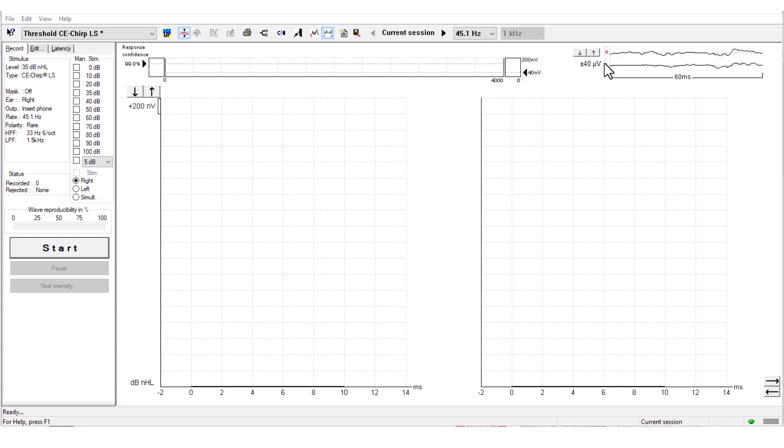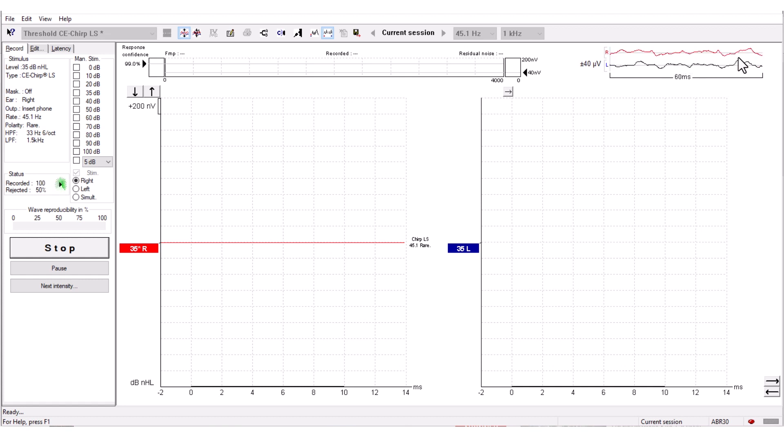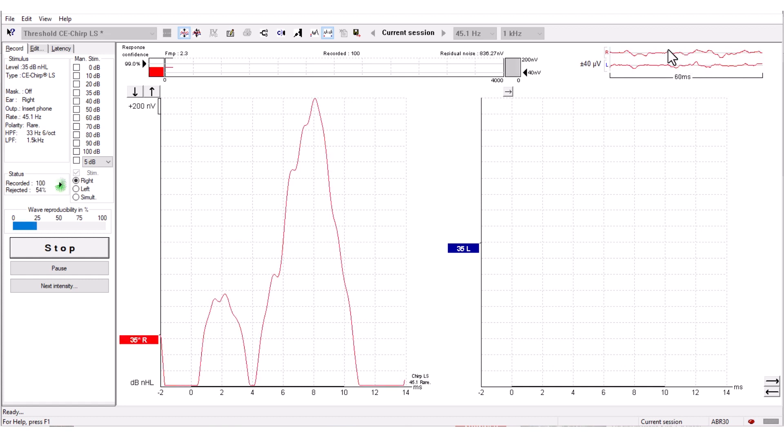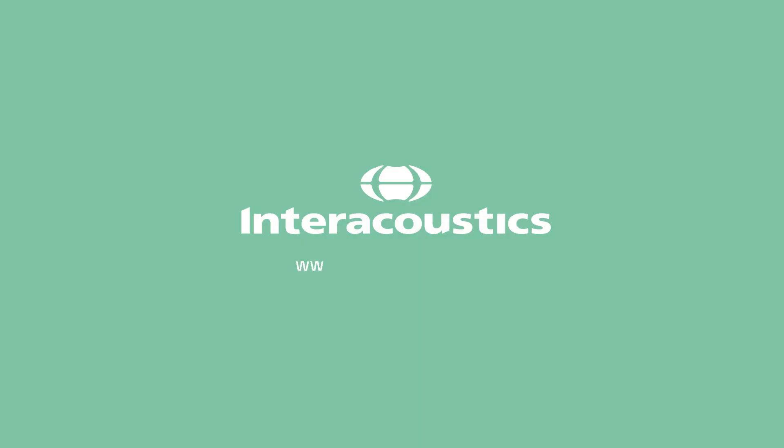The rejection level is here in microvolts. If the EEG turns red like this, then the EEG exceeds your rejection level and the sweeps will be rejected.